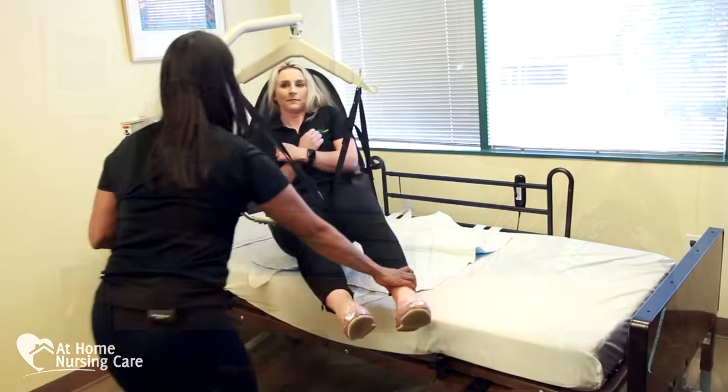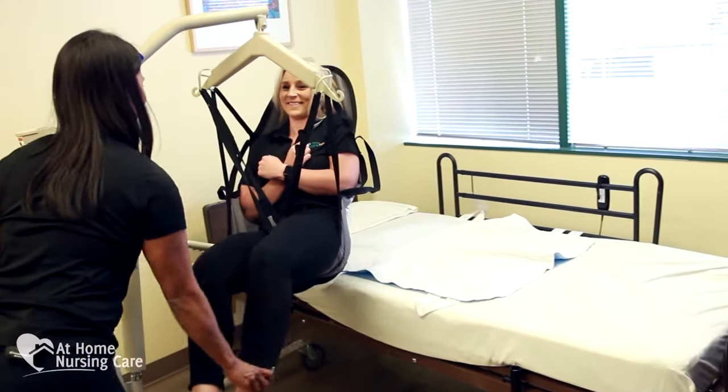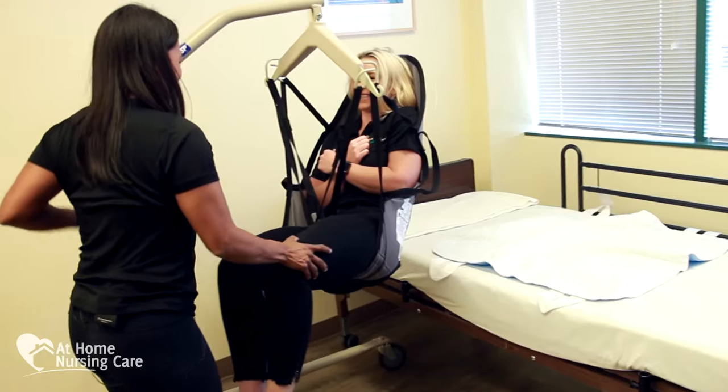Hi, I'm Lauren Reynolds with At Home Nursing Care, and I'm joined by Michelle Gaila from RenewHealth. Today we are going to talk about the Hoyer Lift. A Hoyer Lift is a safety assistive device that helps individuals with limited range of motion or who have trouble getting out of bed. It's an assistive device that helps with safety.